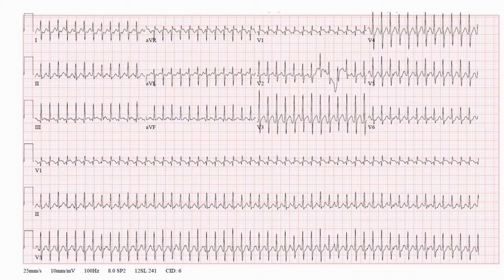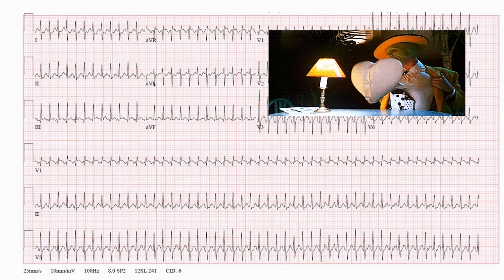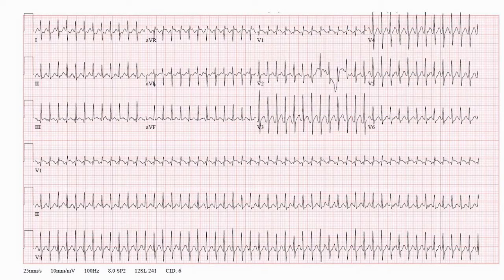Thank you guys for having me today. It's a pleasure. The EKG essentially is used to analyze the electrical system, or electrical properties and conduction, of the heart. The heart uses a mechanical component to pump blood, but it also drives based on its own intrinsic electrical system, and so that's what the EKG analyzes.